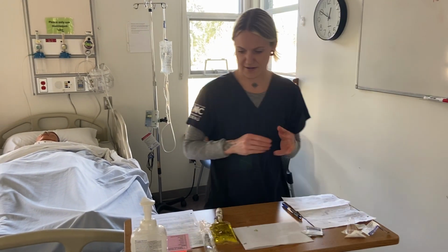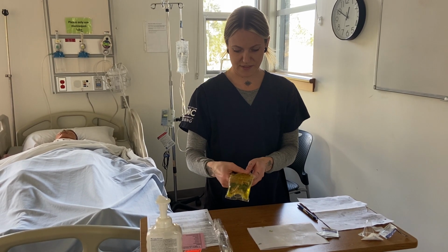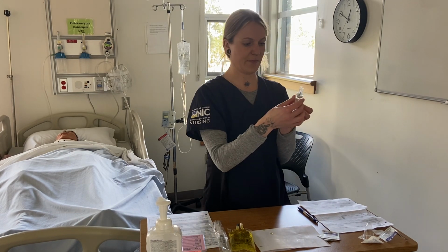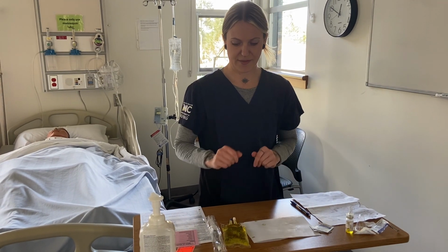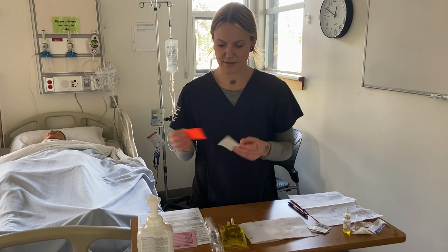Okay, and my 3rd check, I will take this out and just confirm again, cefazolin not expired, so then I would put this into sharps. The next thing I will do is put on a label.